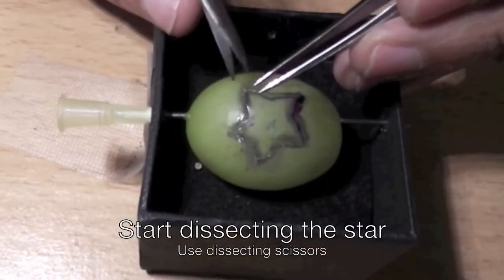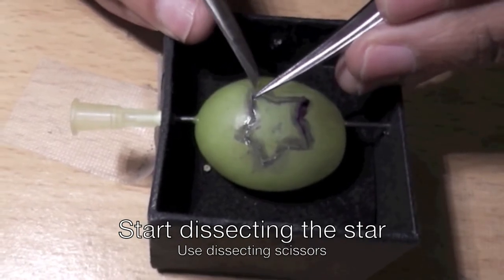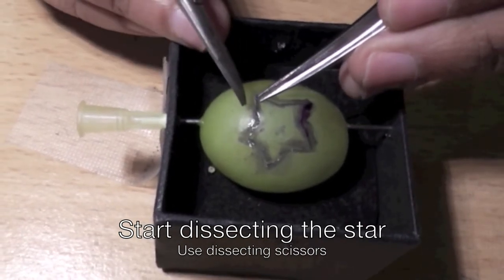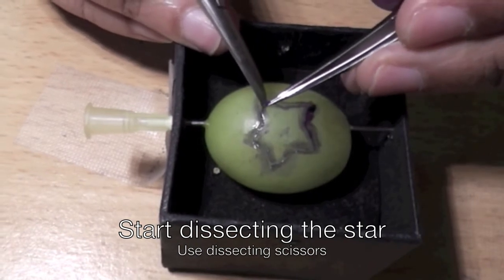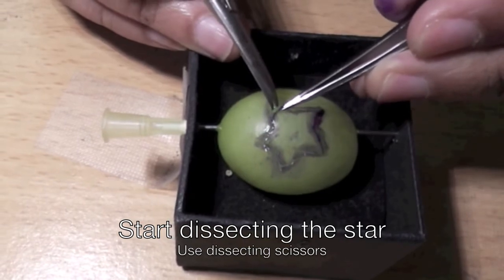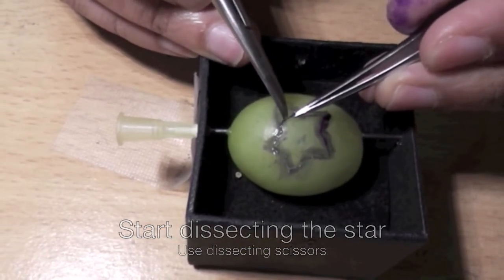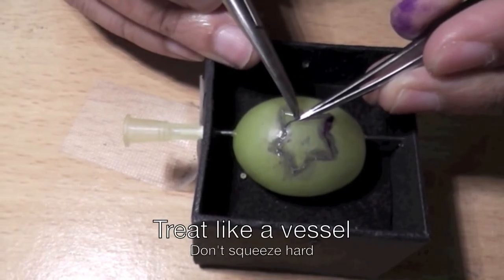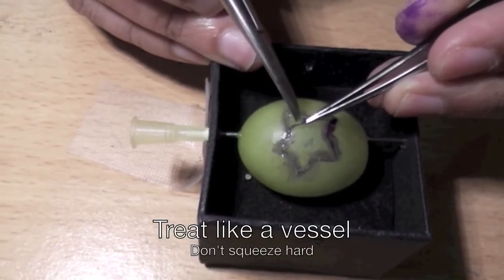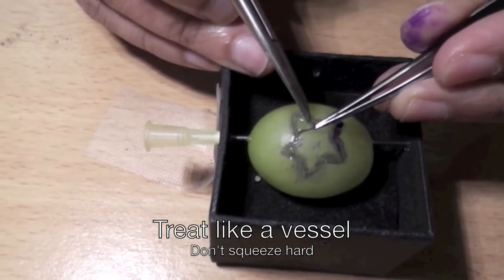This is supposed to introduce tissue handling at the microscopic level, so you try not to squeeze it too much. Leave as little flesh of the grape on the skin, and not cut into it, or not create any perforations.